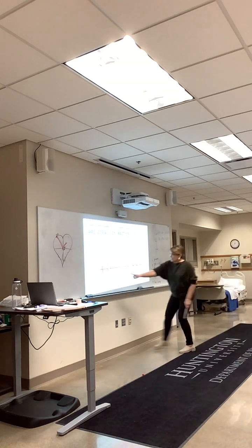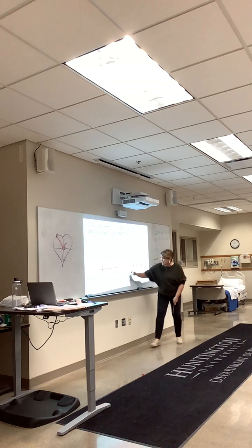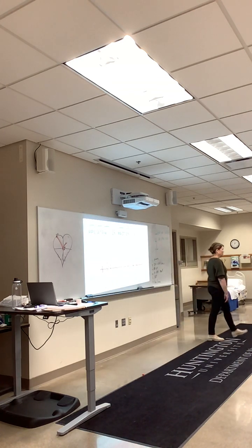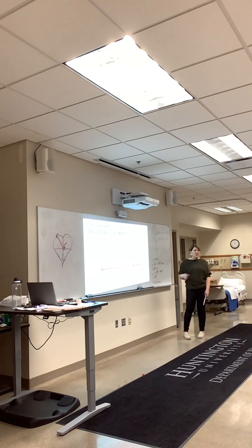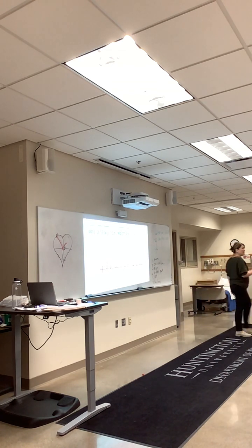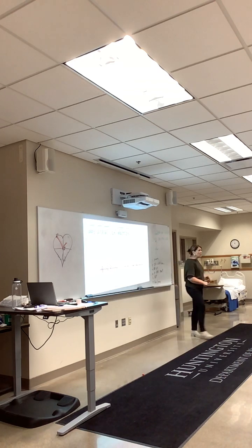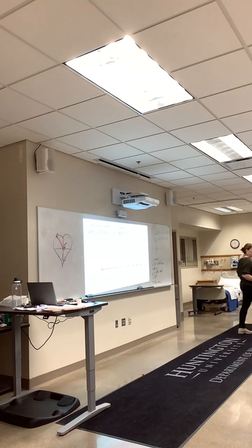This one I can't really see. I have a little bump here. That's actually my P wave stuck in here, but it just came earlier. Everything else looked the same. So when I'm talking about this one, I'm going to call this a normal sinus rhythm with PACs, because everything else is normal with it. So it's a normal sinus rhythm, but it has some extra beats in there. That usually comes from something like lack of oxygen to your heart, or too much caffeine, or stress, or not enough sleep. It'll cause you to have some PACs going on in there, all right?